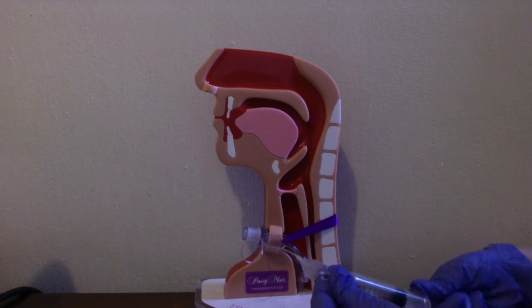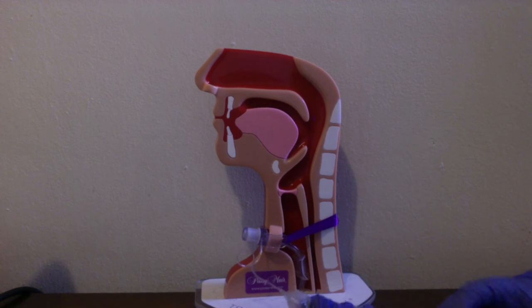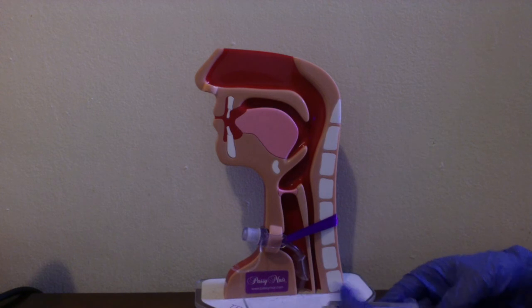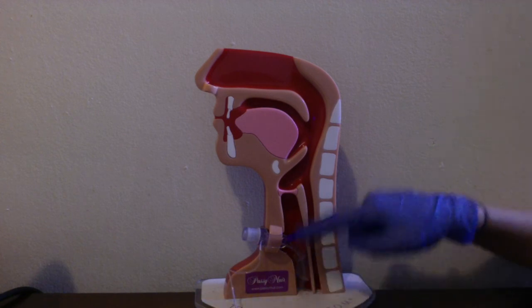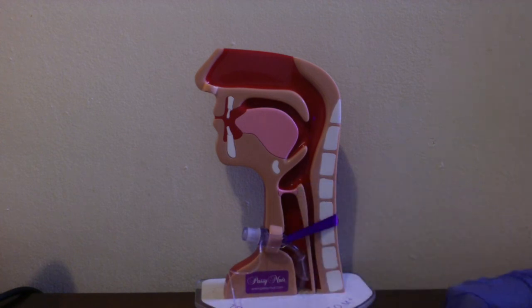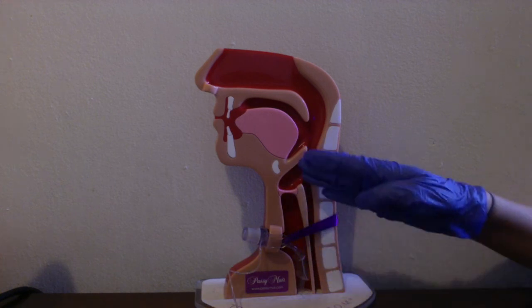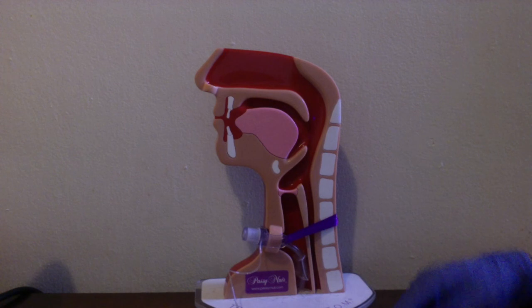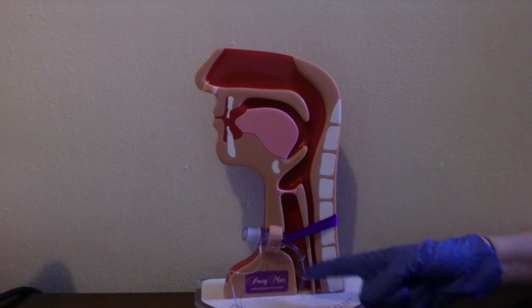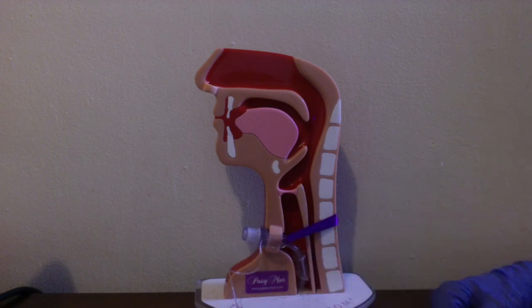Once the cuff is fully deflated, the patient will not only be able to breathe in and out through the tracheostomy tube, they will now be able to breathe through that upper airway as well. Airflow will take the path of least resistance, so some of the air will come up through the vocal cords to produce voice and possibly improve swallowing, and some of the air will still flow out through the tracheostomy tube.